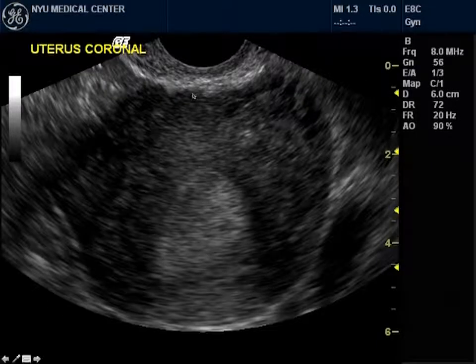So for instance, this is an axial uterus. See how the endometrium is in the same plane as the footprint of the sound. If the endometrium were here, that's an anteverted uterus. If the endometrium were here in a retroverted uterus, you would see better. But in this axial uterus, you don't see a gestational sac. Well, I'll get an hCG and I'll tell this patient, I expect her hCG to be greater than 50, less than 1,000, in which case I would repeat it at appropriate intervals until I can see something on ultrasound.